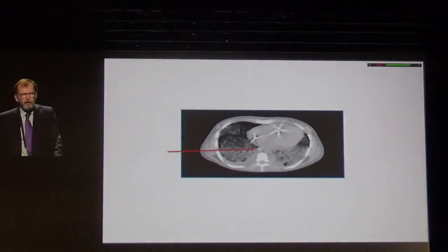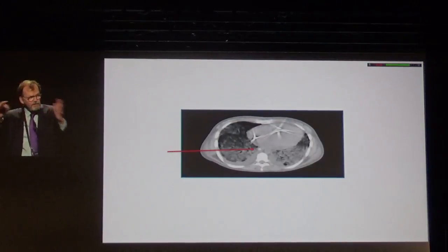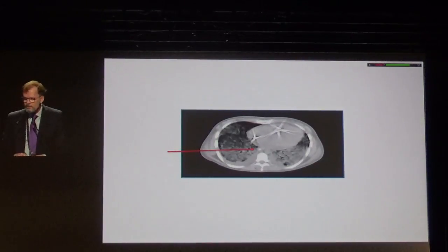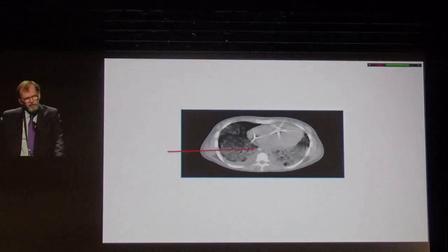The question which is often raised is, what does this pressure exactly measure? And the response is simple: it measures the pressure in the esophagus. Okay? What does it mean? It means the esophagus is in the chest, but it has a location in the chest. And this location, as you can see, is approximately mid-chest, maybe a little bit down. It depends exactly where you are in the chest.